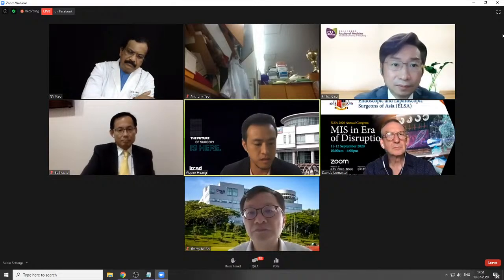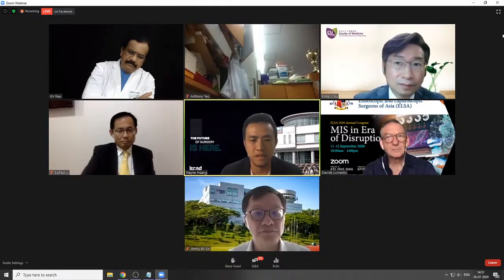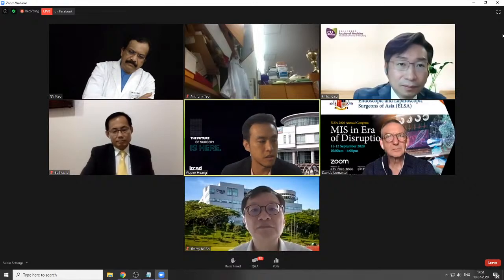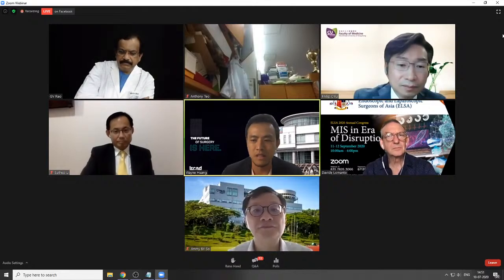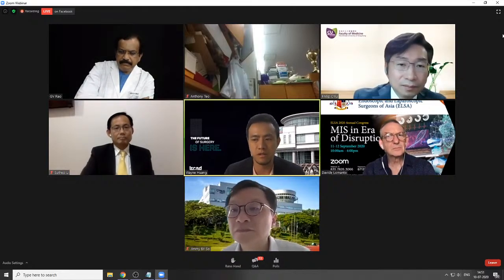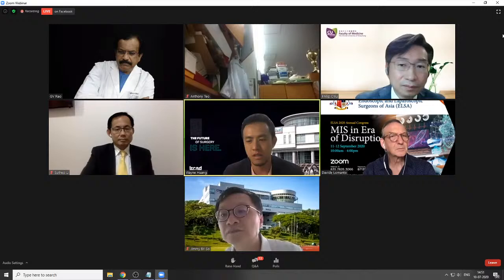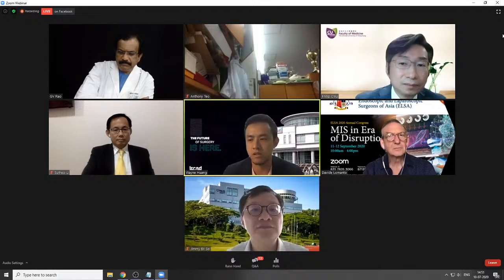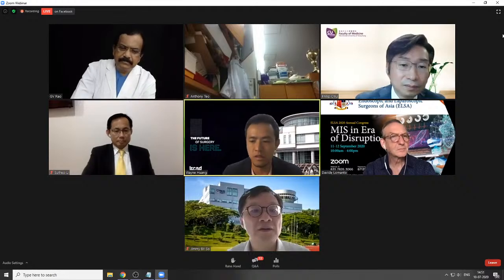I think all the training needs to combine all the experts, and that's a great thing. We have all the experts in Asia, and we can help each other conduct courses. We just need to redesign and rethink them. We don't always need expensive models. Sometimes it's just an ex vivo porcine stomach, and you create a situation like a leakage or a fistula, and then you can ask the participants to perform the training very well.